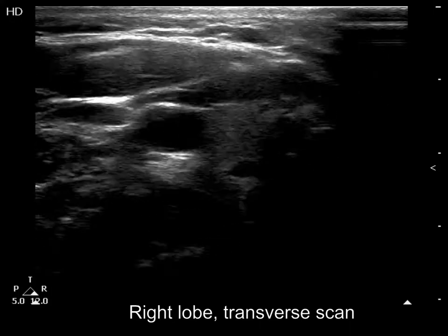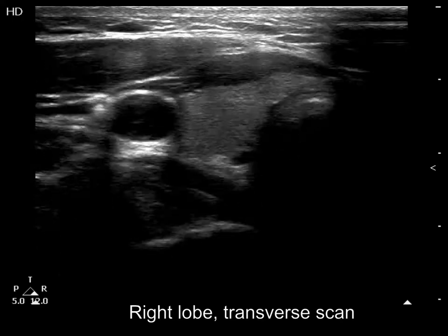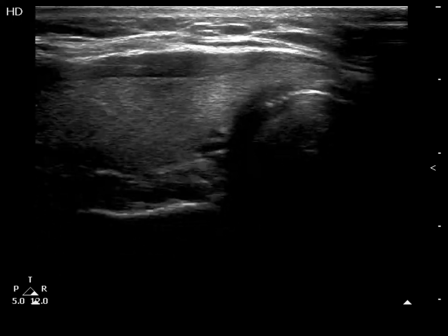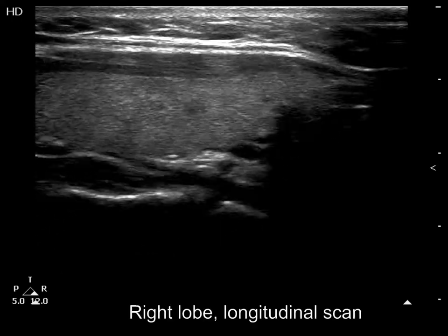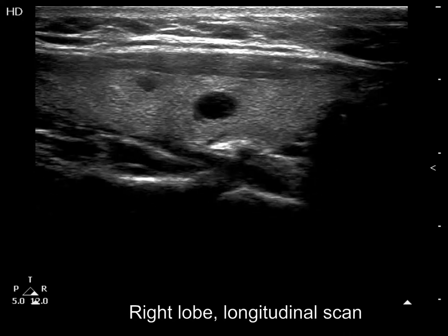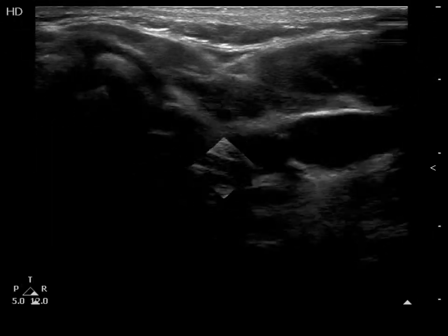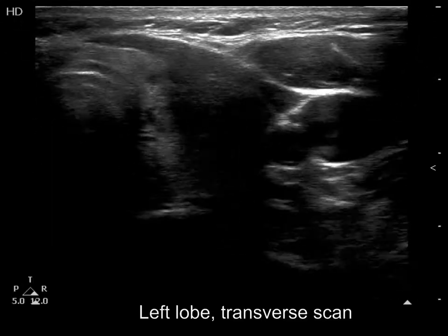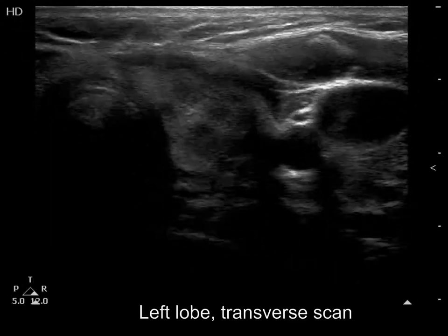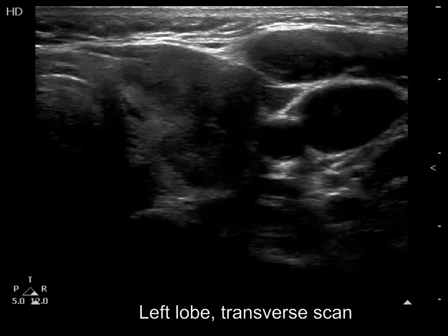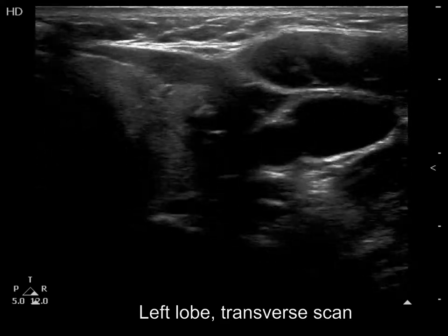The right lobe is echonormal. There are two cystic areas within which correspond to dilated macro follicles. There is a mass composed of multiple hypochoid nodules, including a mixed lesion which presents with blurred and irregular borders.